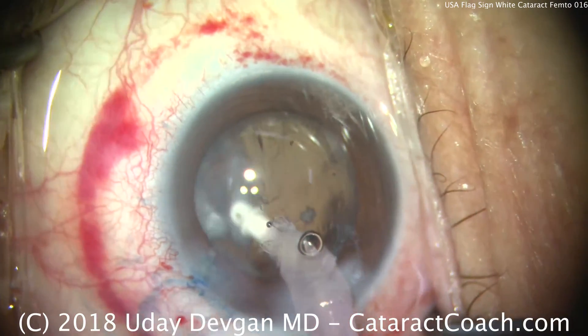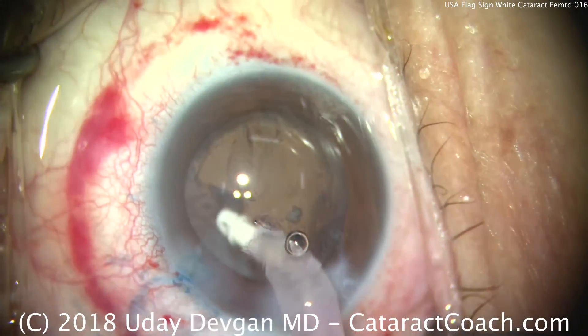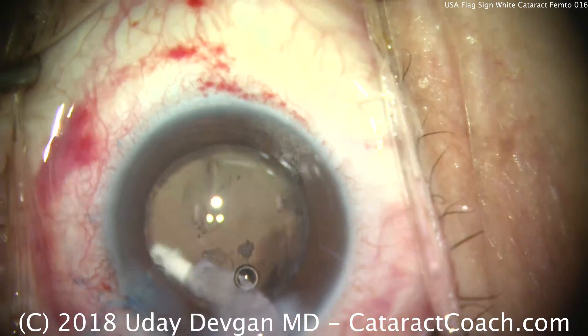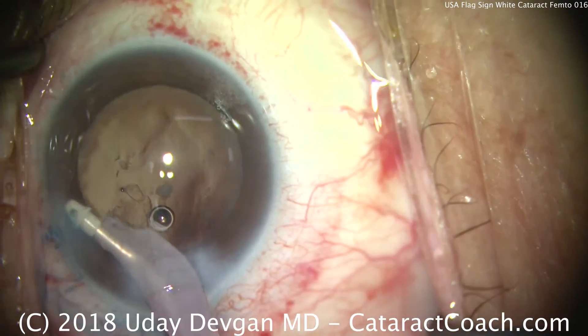The IA probe is used to remove the remaining cortex and any other wispy lens material. And the eye is looking pretty good. At this point, the patient who's under topical anesthesia is just surprised to finally be able to see so many lights.